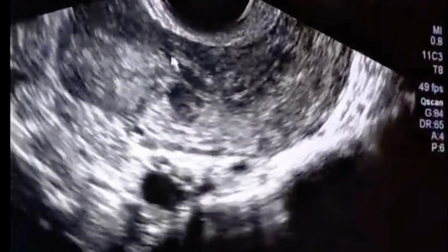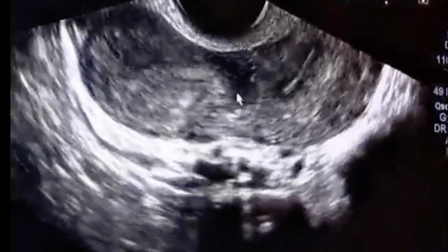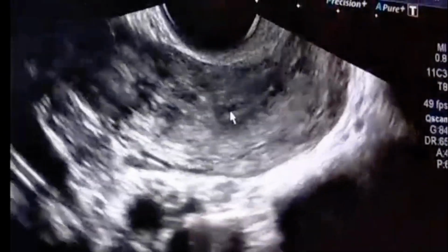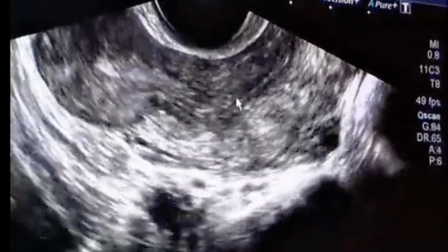So this is a rudimentary horn of the uterus. This is the lining of the endometrium, and these are connected to each other.